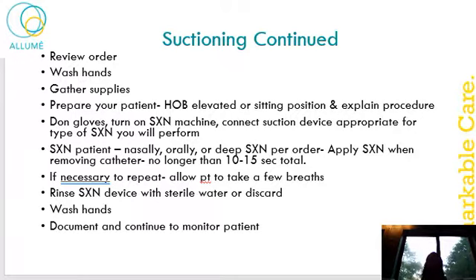A lot of times when I'm doing orientation, I tell the nurses to hold your breath so that you can feel what the patient feels. So make sure that we don't go over that 10 to 15 second total. If it's necessary and you have to repeat the procedure, please allow your patient to take a few breaths before you go back down and suction them. It's very traumatic for somebody, so we always want to be conscious of that.